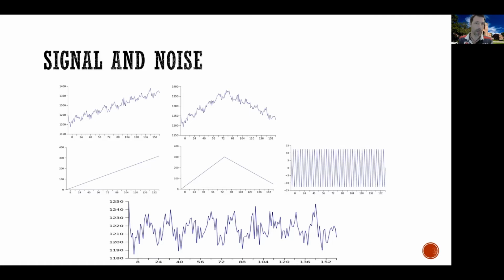So I can explain stuff that changes at the periodicity of my task, which is 16 seconds on, 16 seconds off. So exactly 0.031 hertz.